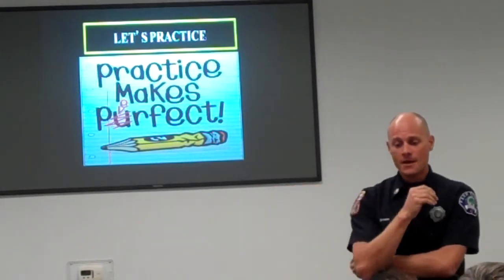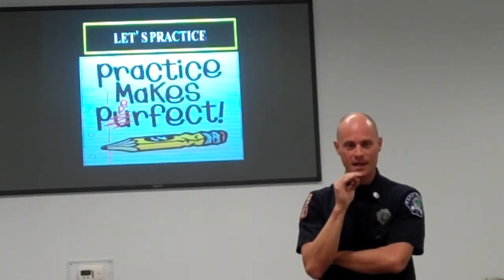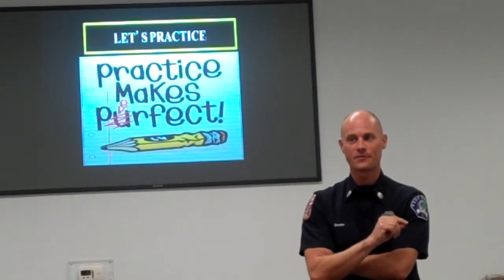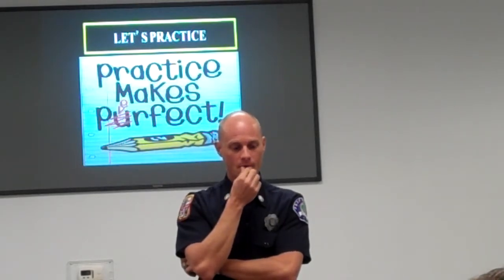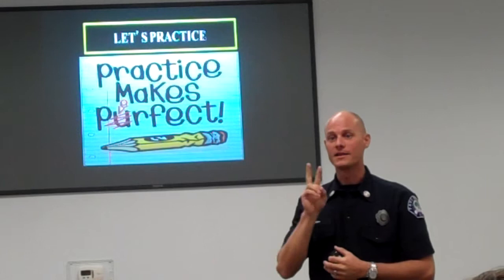Okay, so if you guys take a look at your cards, let's say you have ST elevation in leads 2 and AVF, but not in 3, is that considered a contiguous lead? We're going to say yes on that because it's looking at the same part of the heart. Okay, so you have ST elevation in lead 1 and V6, but not in V5 and not in AVL. Would that be considered 2 contiguous leads? Yeah. Absolutely. Okay, good. So that's all we're looking for. 1 small box or more and 2 contiguous leads.